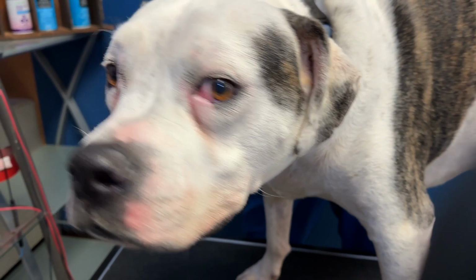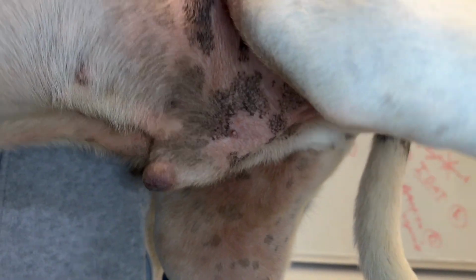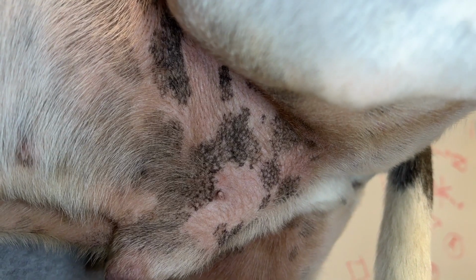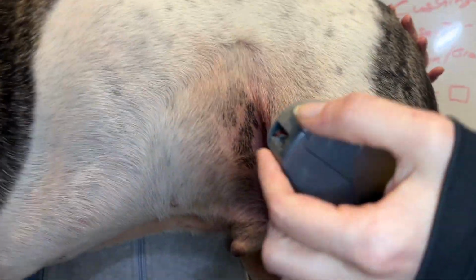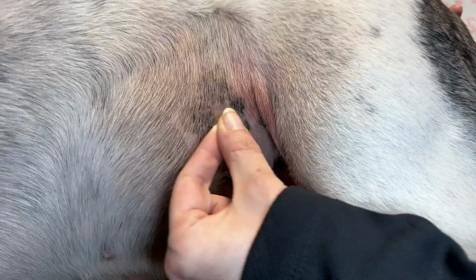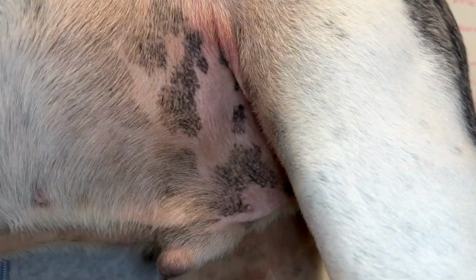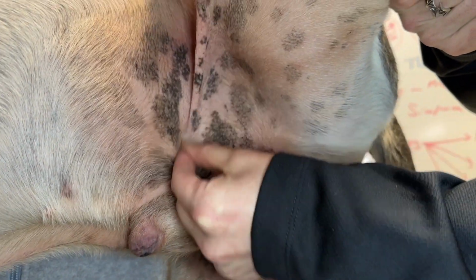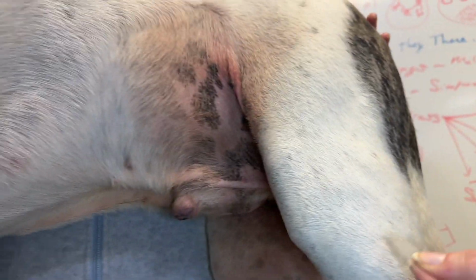This is Petey. Petey has allergic dermatitis, and 80% of dogs with allergies will have secondary infections. The leathery skin is very typical of either bacteria or yeast, Malassezia. We need to collect a sample to look under the microscope for microscopic cytology to determine if we have yeast Malassezia or bacteria or both.